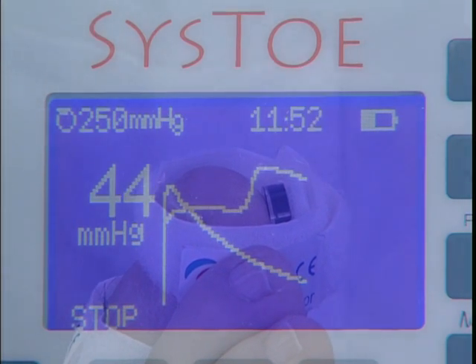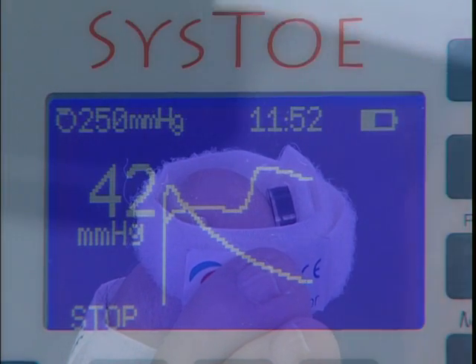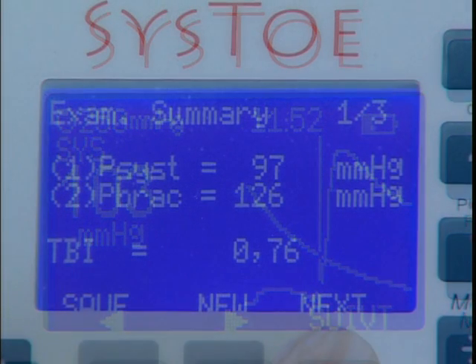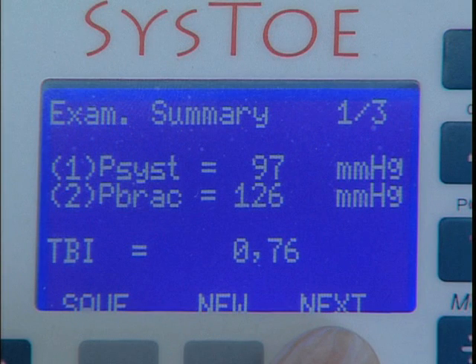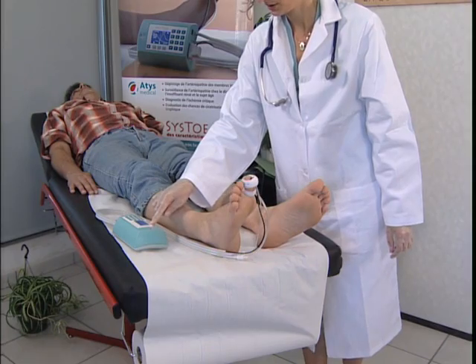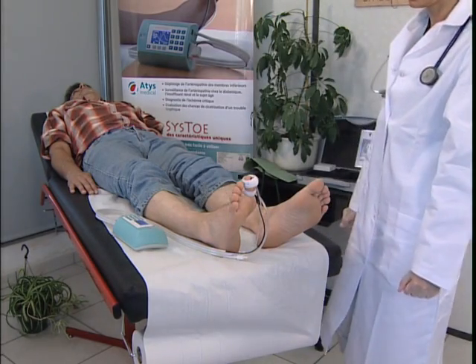At the end of the procedure, the toe's systolic pressure is displayed on the screen. A cursor positioned automatically on the plot of the infrared signal shows the point at which blood flow resumed. If the brachial pressure was put in, the TBI is also calculated. The measurement is then repeated on the first toe and the same procedure is carried out on the other big toe.